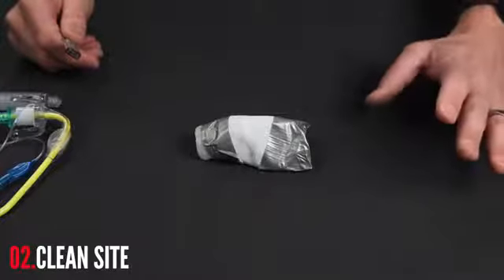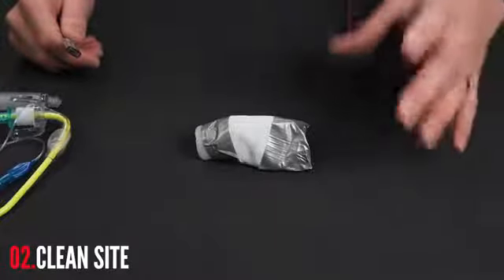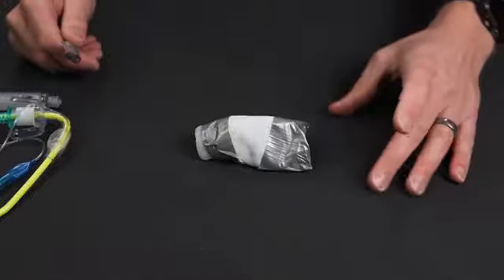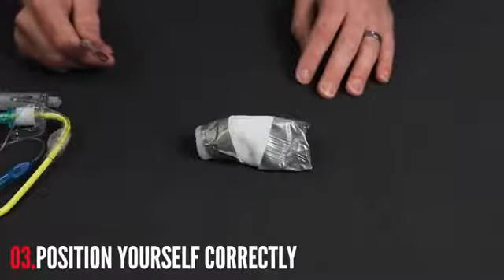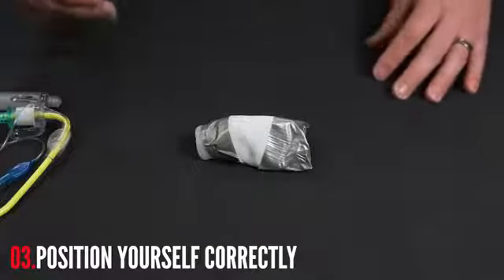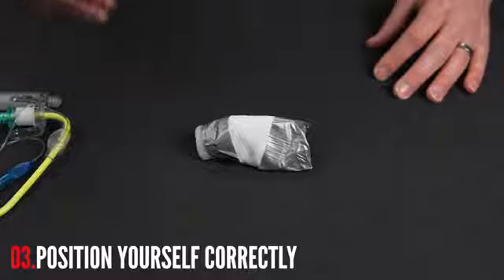So it is the right thing to do to sterilize that site. However, in hyper-emergent situations where you're just trying to get an airway, that might not occur. When we position ourselves next to the patient, we make sure we are on whatever side is dominant. We need to be on that side of the patient.